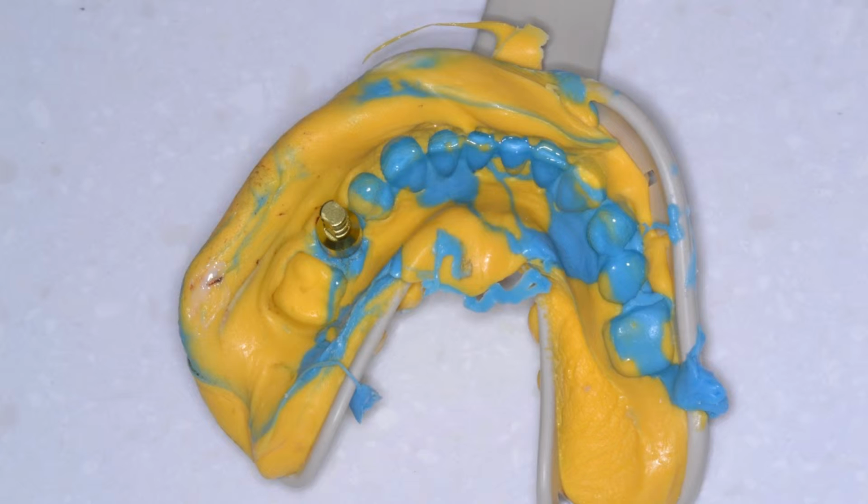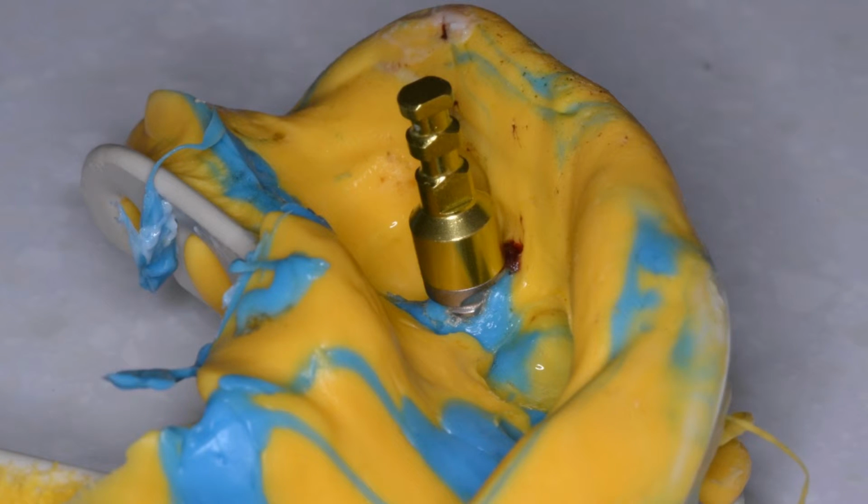So in this photograph here, you can see basically that fixture analog inserted into the impression. You can see in this case blue is the light body material, where that light body material really helps give us detail. And you can see by the implant there, there's not really a lot that we put in there. It's mostly heavy body that's holding that impression coping in place. So like I said, use light body. It gives you that much more detail in your impressions.